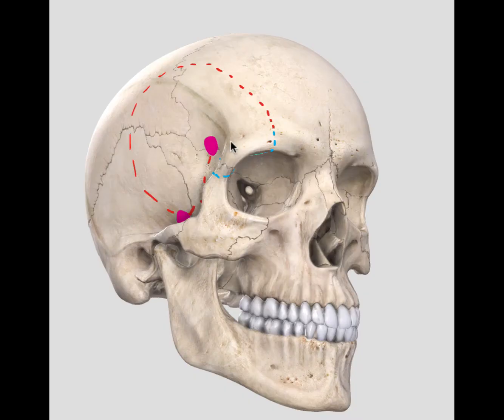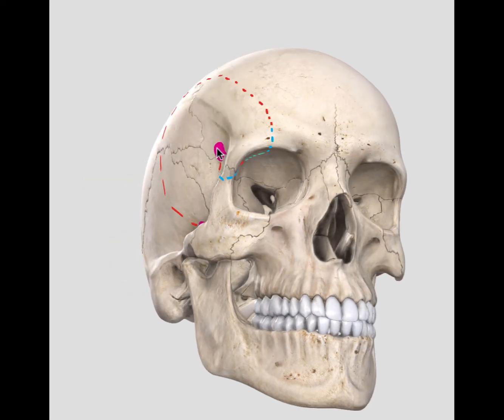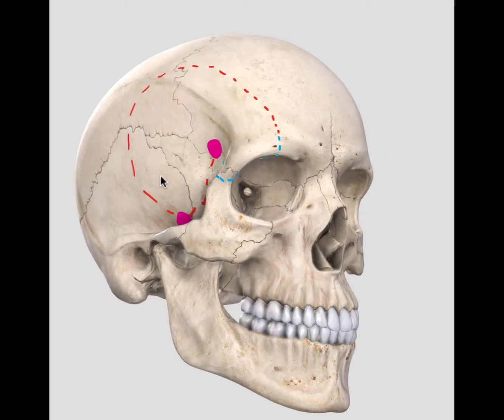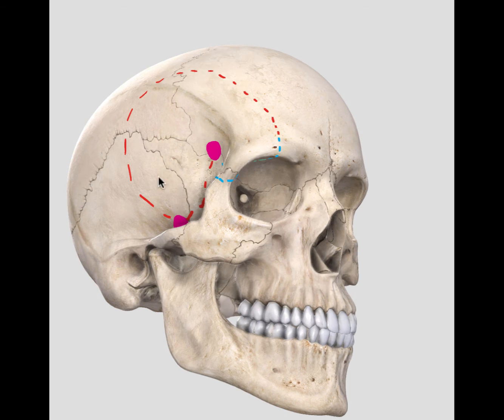The last maneuver to raise your frontotemporal orbital zygomatic flap — this modified craniotomy in one piece — is to lift this cranial flap once you have made all the cuts and propagated the fracture. And that way you will have this frontotemporal orbital zygomatic craniotomy in one piece.